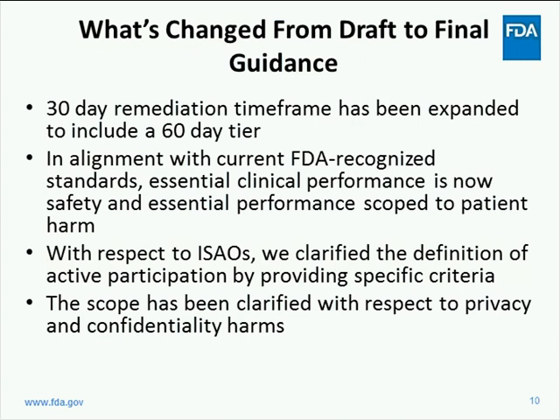We received many questions about ISAOs, the Information Sharing and Analysis Organizations. In the final guidance, we clarify the definition of active participation by providing specific criteria. And finally, the scope of the guidance has been further clarified with respect to privacy as well as confidentiality harms.